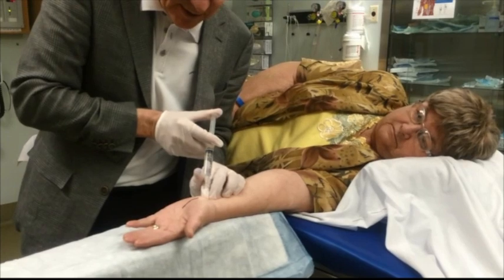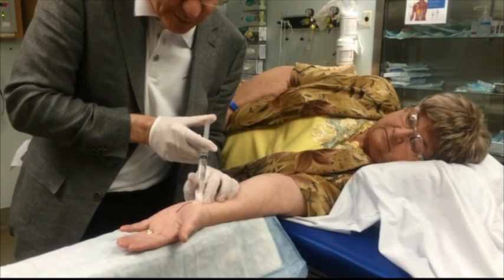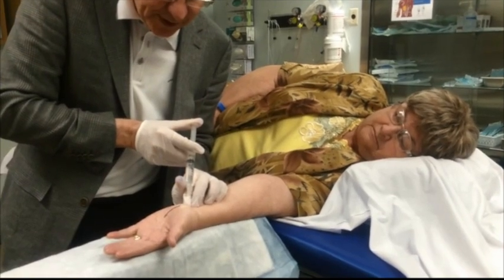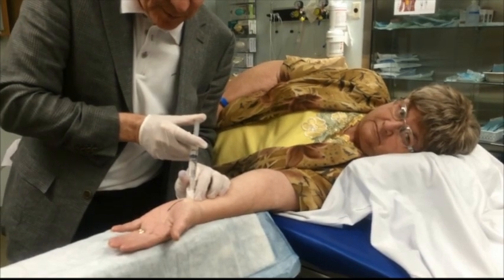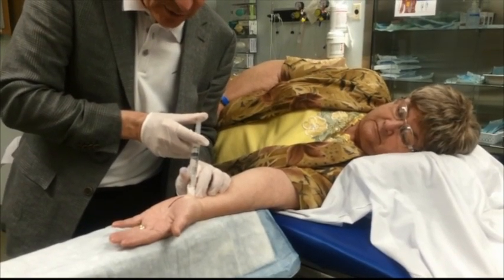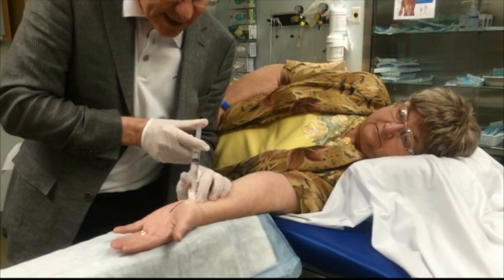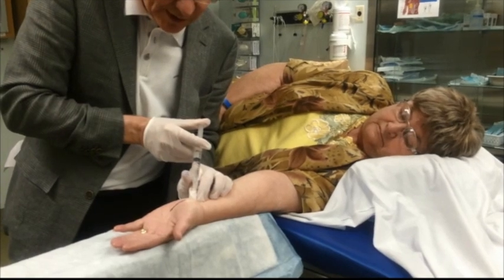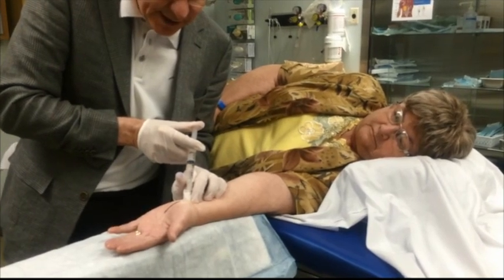This syringe had eleven cc's — a ten cc syringe. It had one cc of 8.4% bicarbonate, drawn up first, then ten cc's of 1% lidocaine with 1 in 100,000 epinephrine. The pH of lidocaine with epinephrine averages 4.2, with a range of 3.3 to 5.5 depending on how long it's been on the shelf. The bicarb takes it to a pH of 7.4. The right mixture is one cc to ten, and a ten cc syringe holds eleven cc's.